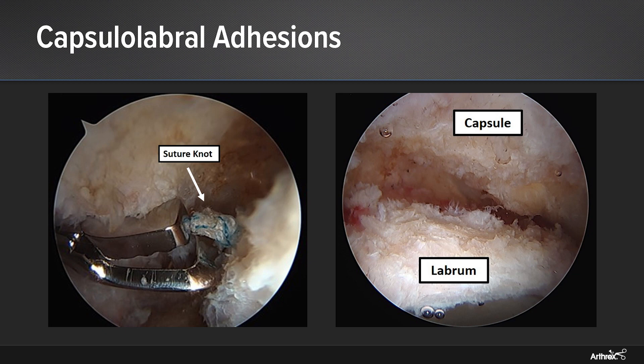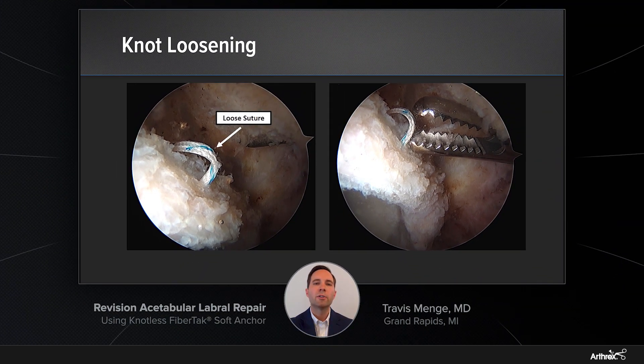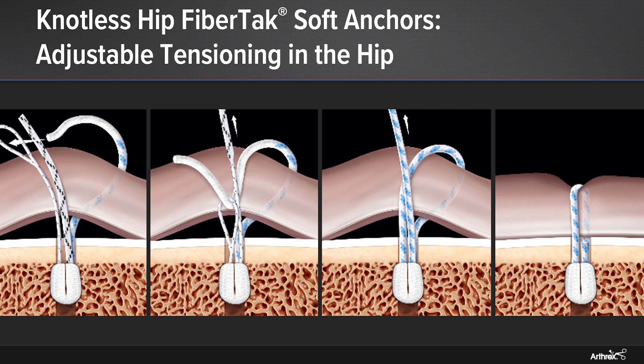She had a prior repair with an anchor that used a knotted construct, and you can see that the suture knot stack and the knots that resulted were directly below the center of that dense scar tissue. As we continue to work, we remove that knot stack and continue to elevate that capsule and recreate the plane between the capsule and the labrum. Viewing from a mid-anterior portal looking posteriorly, another one of the anchors had a suture which had loosened from her prior surgery. We went in and removed this loose suture, which again, with a knot, was one of the problems with this particular construct. It is for these reasons that I have switched in my practice to the knotless FibreTac anchors for all of my hip arthroscopy cases.